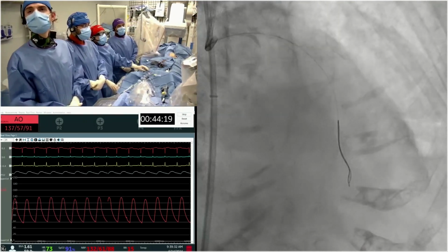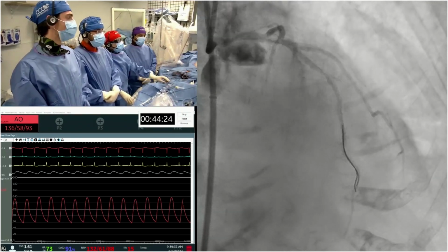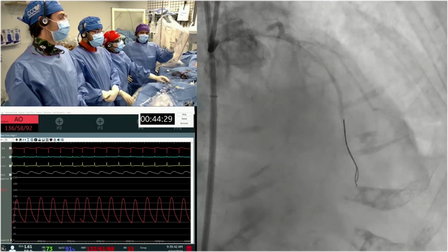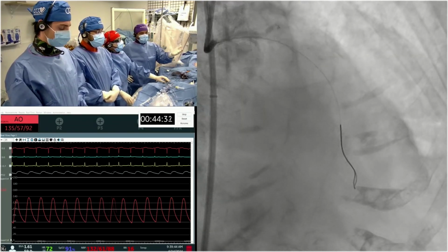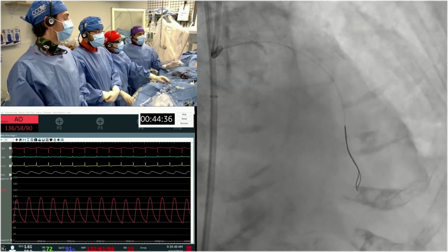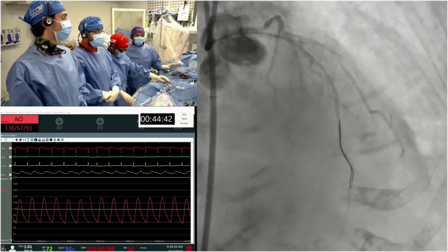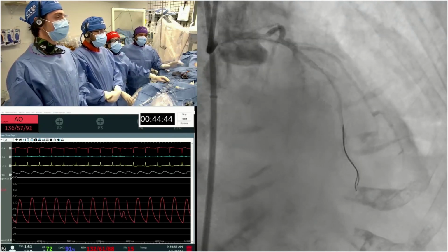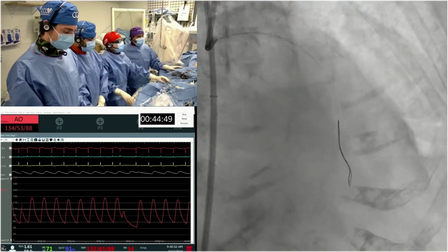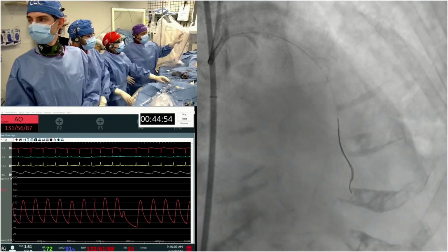Usually, as you know, with this patient, we were thinking originally whether we should put in a balloon pump or not, or an Impella probably would have been needed. Knowing that the right is normal, second, it's not a bifurcation left main, and third, EDP was normal and the ejection fraction about 60%, we felt, let's go without it. So clearly, we'll say that you put a pacemaker only on the right side, but we have seen many of the left mains also become asystolic. So this patient required atropine. We were almost close to putting in a pacemaker, but didn't need it. As you pointed out, clearly getting slow flow and the bradycardia.